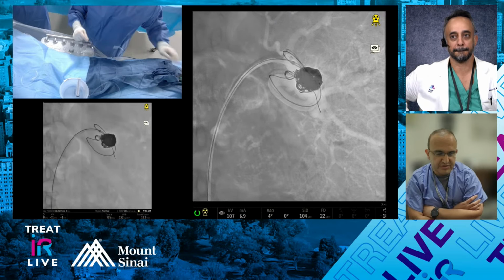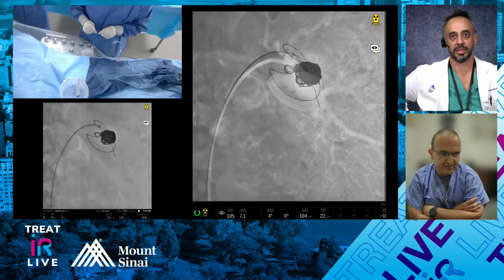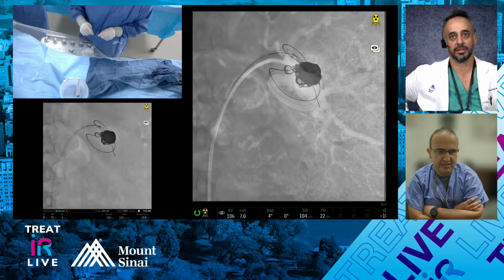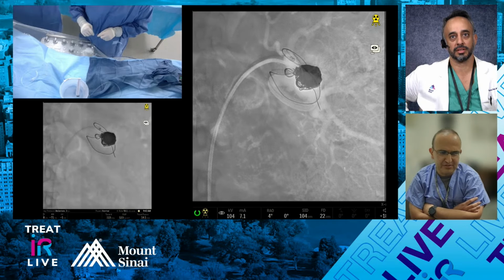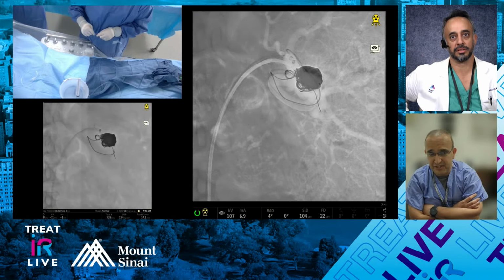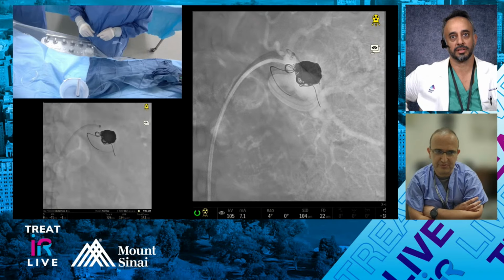Yeah, no, at Georgetown we don't get much from, but when I was at hospital center, definitely, like you said, I'm old school too. I oversize a little bit, and like you said, the coil determines it a little bit too, if it's really stiff or soft or whatever, and what setting you're in. So I oversize a little bit by like 10, 15% for most coils.